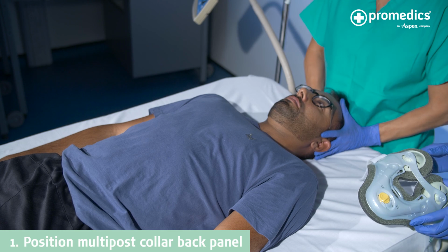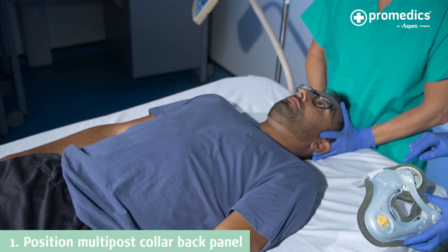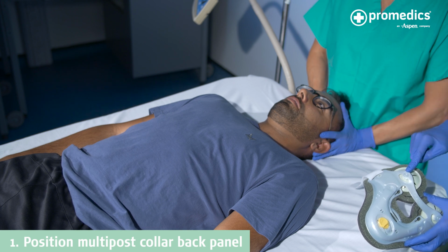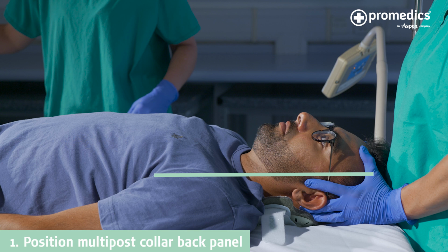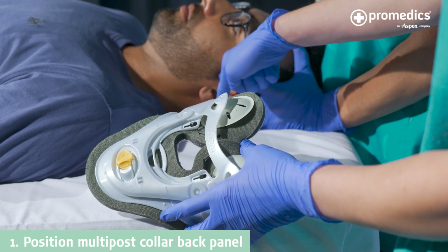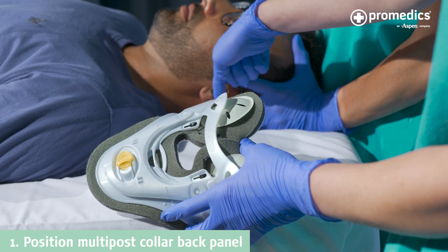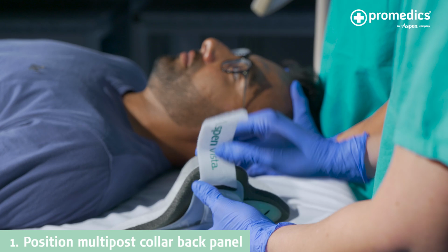The first step in fitting a 2-post CTO is to position the multi-post back panel. One person is to stand at the head end of the bed, performing a head hold to maintain a neutral alignment of the cervical spine until the collar has been fully fitted. The second person positions the back panel next to the patient's head, between the patient's earlobes and the upper trapezius muscle. The Velcro straps should read Aspen Vista the right way up to the person fitting the collar.